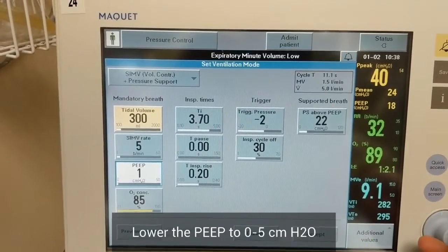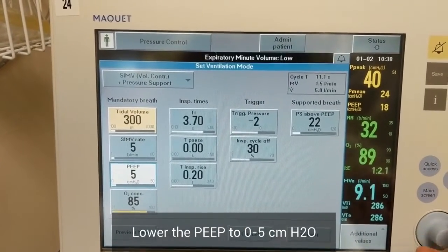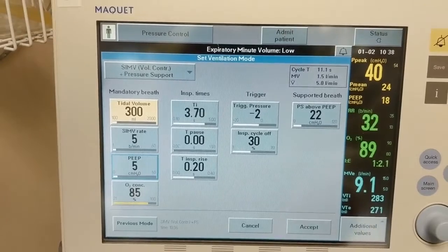Next, drop your PEEP to either 0 or 5 cm of water. Then accept to begin the maneuver.